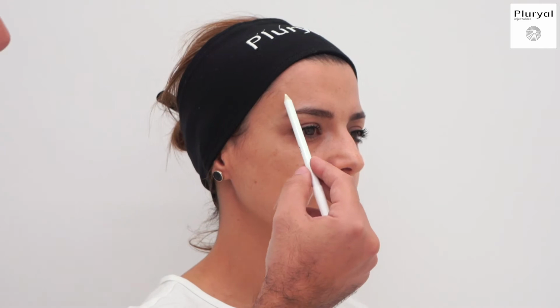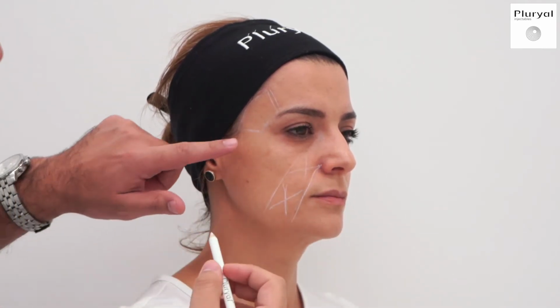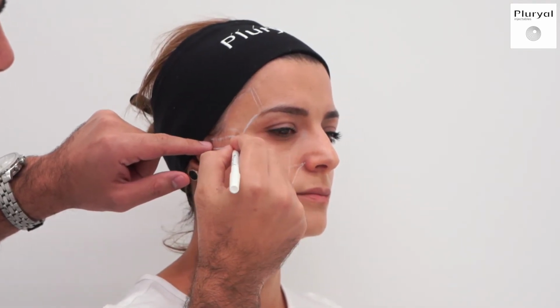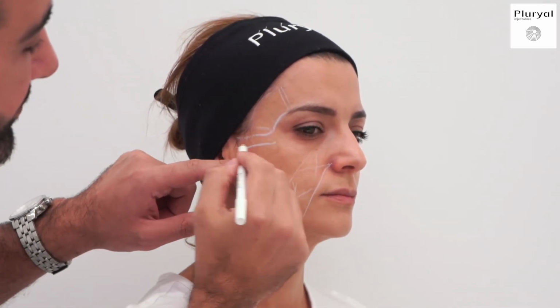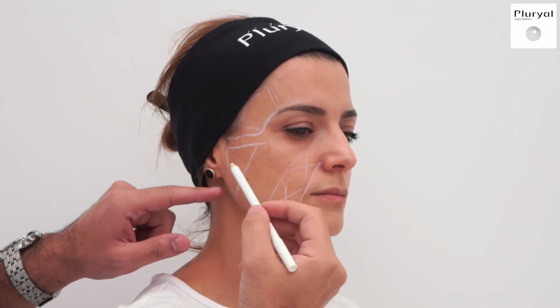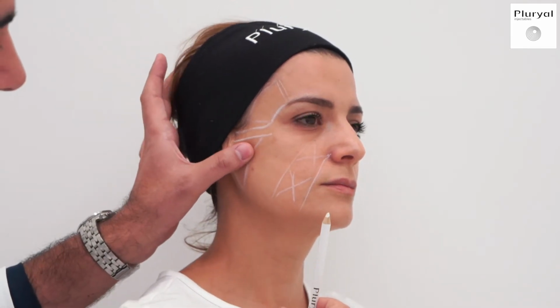First, we're going to start with the temple area. We will be filling this area. Here we have the cheekbone that we will also be filling. After that, we have to go to this triangle, because we have to blend the cheek and this area to do the lifting effect.